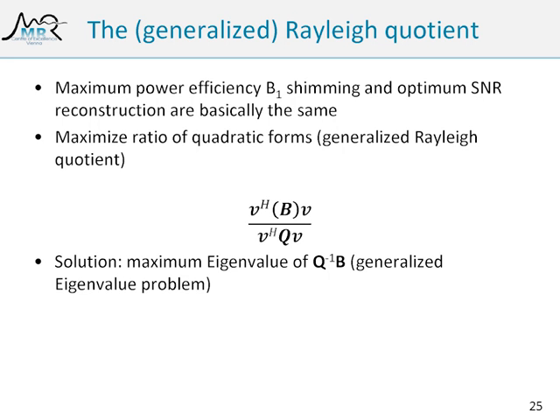So, but for reception, what's the problem? We also get noise. And what do we want? We don't want maximum signal or something. What we are interested in is maximum signal to noise ratio. That's the signal part. The signal is proportional to the magnetic field, to the B1 at that position, but we want to maximize the ratio of signal to noise.